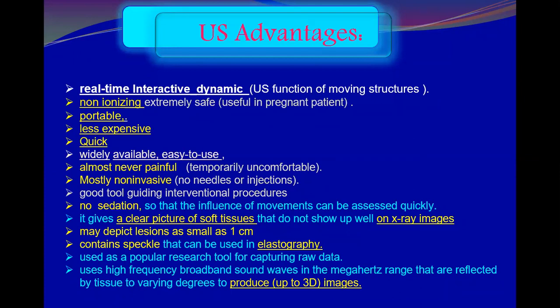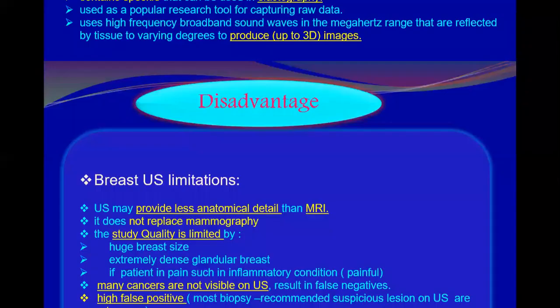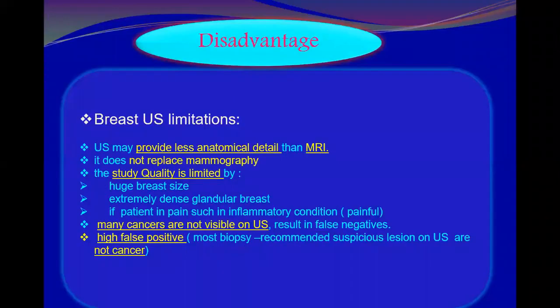There are many advantages of ultrasound. What are the disadvantages of ultrasound? Operator dependent, depends on the skill of the operator. Excellent. You mentioned the most important. So for breast ultrasound, we can mention limitations first, then go to the most important disadvantages.